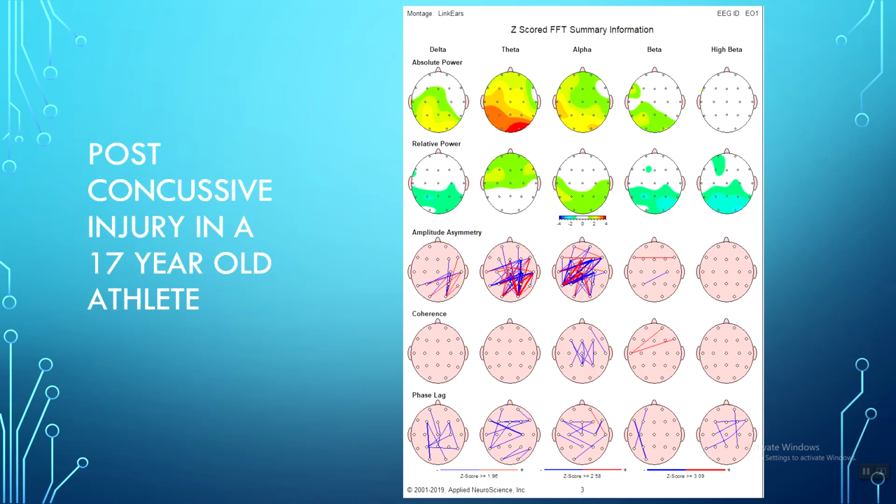and create head injury. And in my opinion, what's happening with theta and delta is because these are frequencies that are responsible for neurogenesis and for neurodevelopment and angiogenesis, it's almost as though the emergency trucks of the EEG are coming to the individual to say, clear the roads, let's do some repair work, right? And very often what you'll see is when somebody who has a head injury closes their eyes, the amplitude of the slow frequencies will magnify. It will get bigger, and it's almost as though their system is saying, oh boy, they're going to sleep. Time to get to work. Time to do our reparative work.